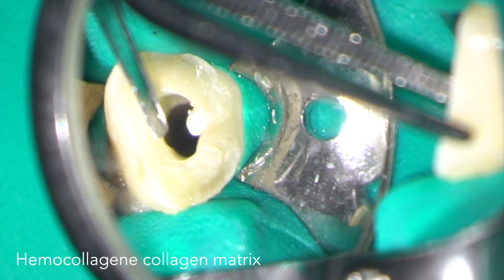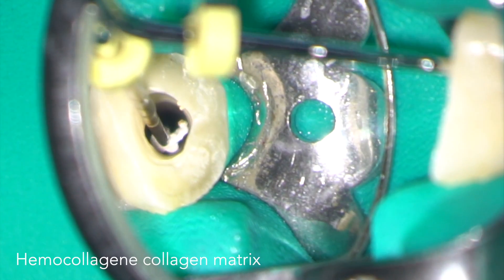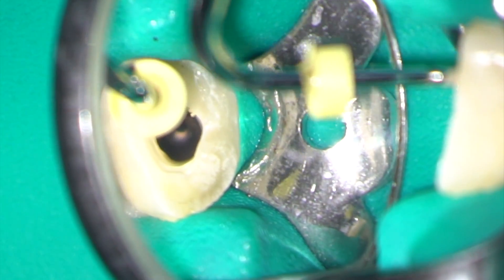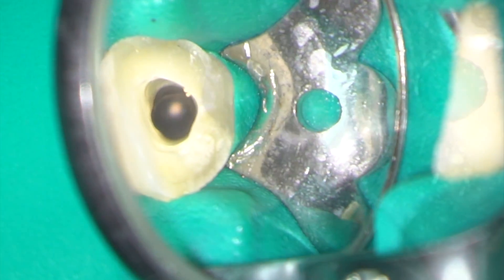I'm now placing a collagen matrix. This is haemocollagen. I can cut a small piece off and then plug it down to the working length using my pre-measured plugger. The collagen matrix provides a barrier onto which I can pack the biodentine. Here you can see the apical plug of collagen.